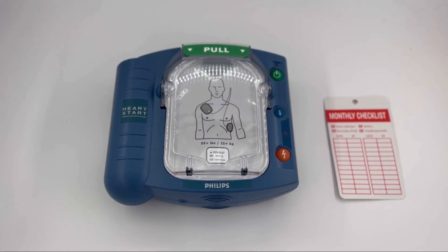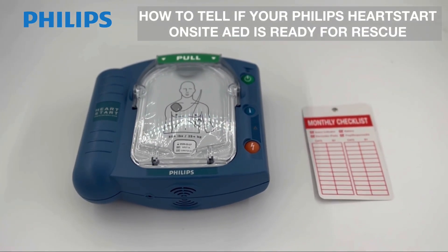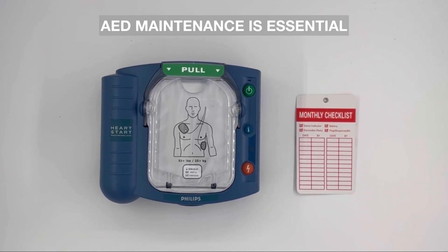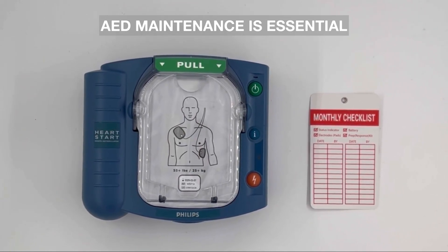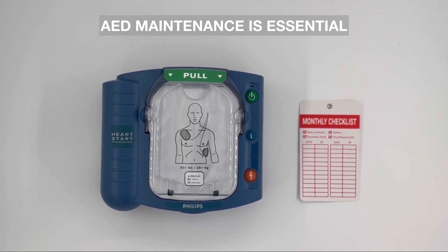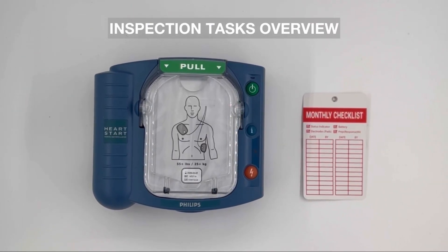This video is presented to you by AEDmarket.com, and today we're going to go over how to tell if the Philips On-Site AED is ready for rescue. In an emergency, every second counts — but what if your AED isn't ready when you need it most? Very often an AED fails because it hasn't been properly maintained. Fortunately, AEDs are simple to inspect and maintain. Here's how to ensure your Philips On-Site AED is always rescue ready.